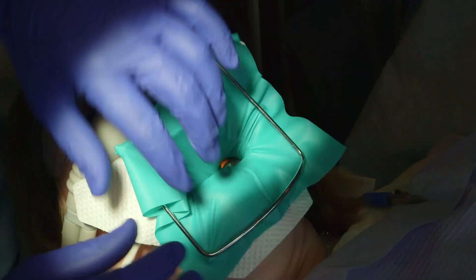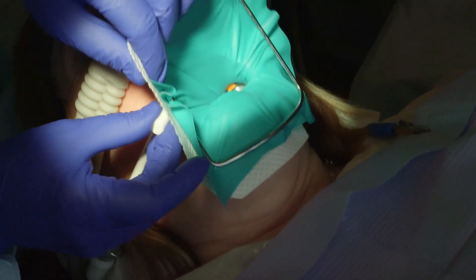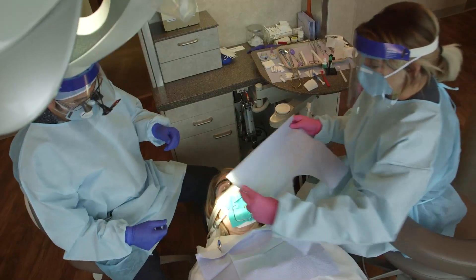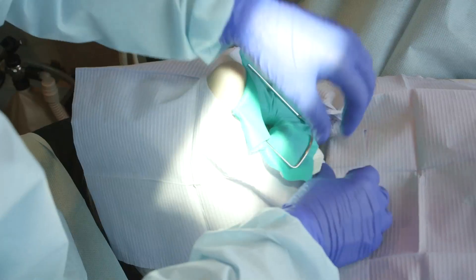A dental dam made with non-latex nitrile material should be placed and properly sealed in the patient's mouth, as well as a full head, face, and neck barrier that is under and around the dam.